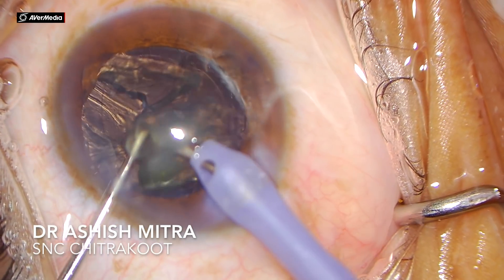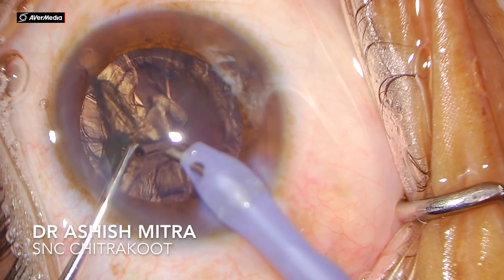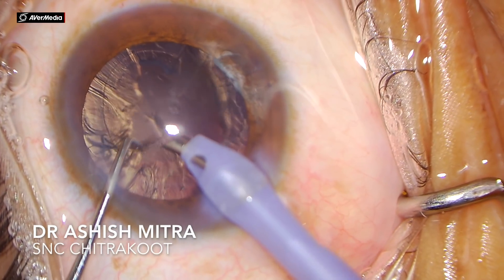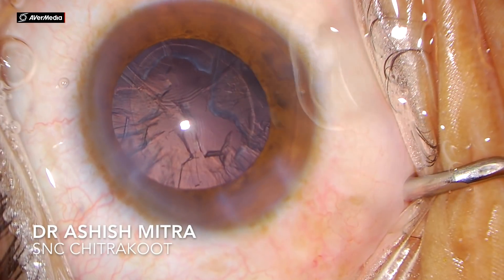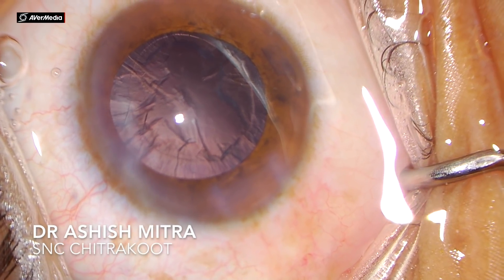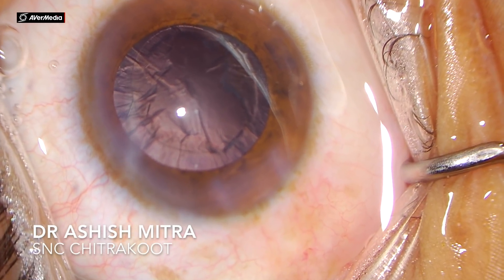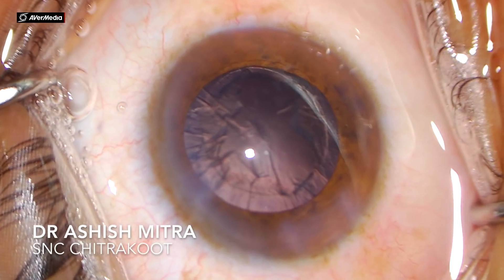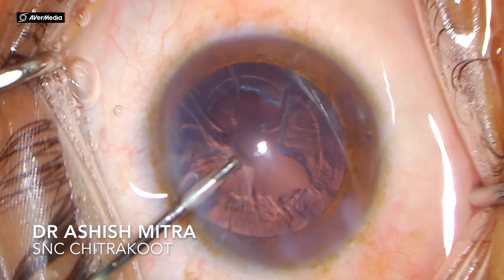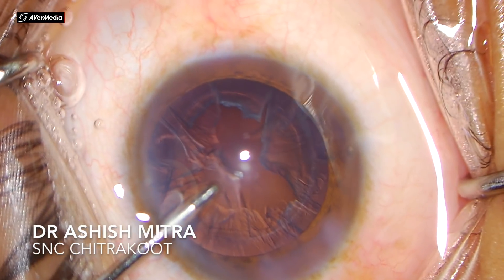This is an advantage of a grade 2 cataract for beginners — what you require initially is to make a trench, divide it mechanically into four pieces, aspirate those pieces into the central safe zone, and then with your phaco probe in foot position 3 give minimal power in pulses to emulsify all four pieces. Now you can see all four pieces were emulsified, and all that is left is the cortical material.